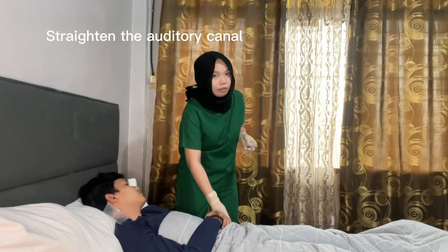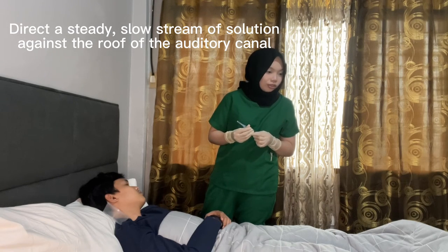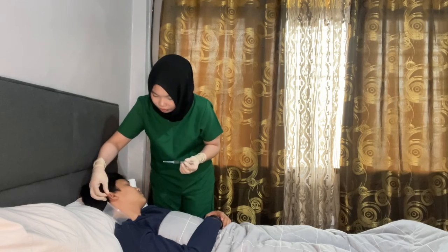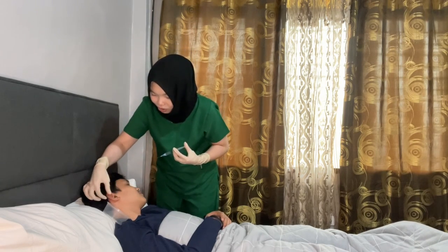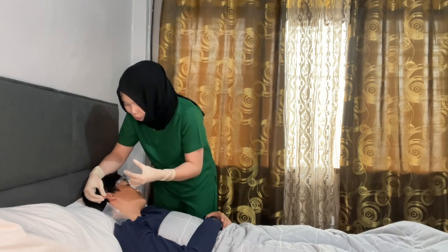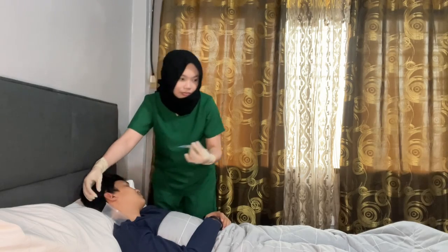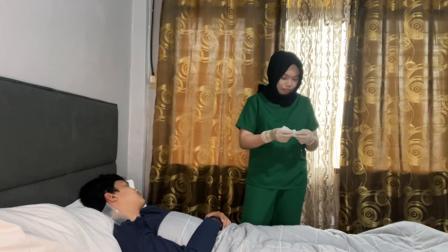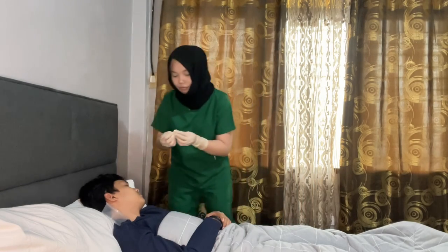Straighten the auditory canal by pulling the pinna up and back. Direct a steady, slow stream of solution against the roof of the auditory canal, allowing the solution to flow out unimpeded. Straighten the auditory canal, then slowly put the solution into the ear — do not touch the ear. Place a cotton ball into the ear.